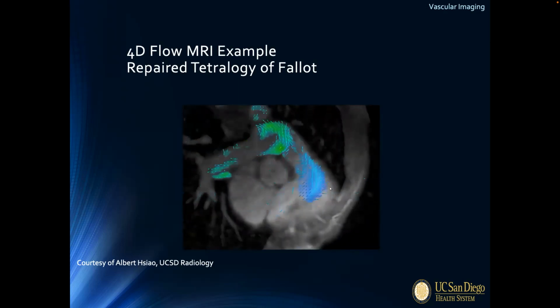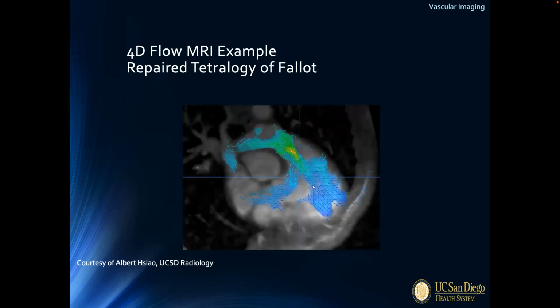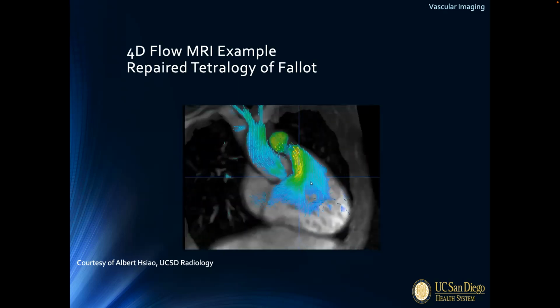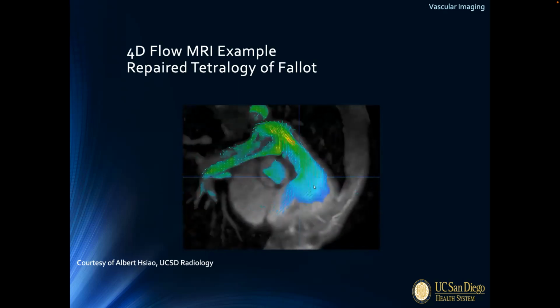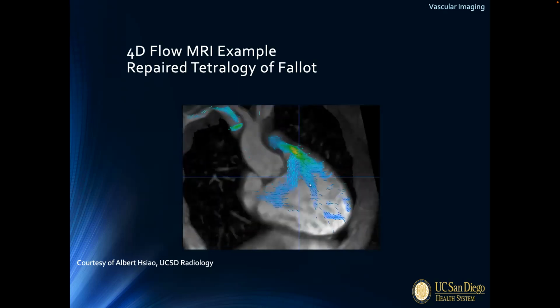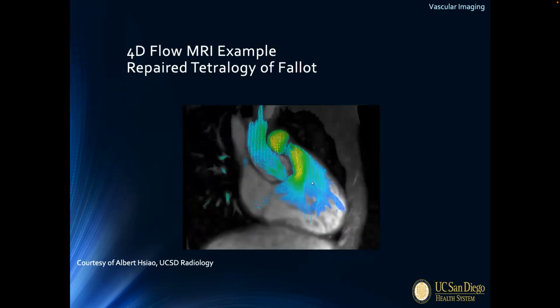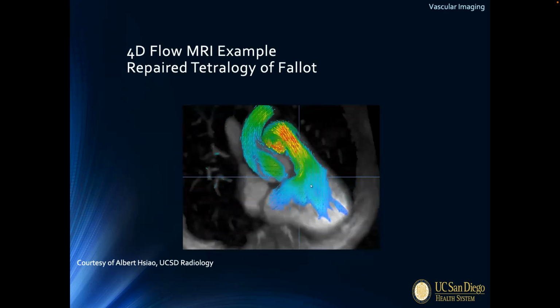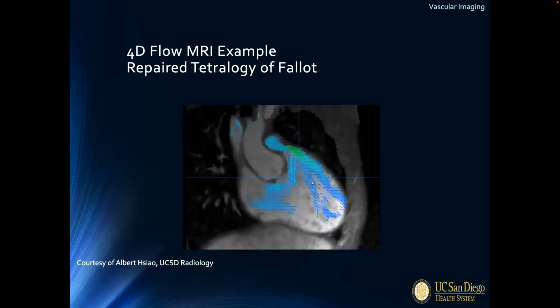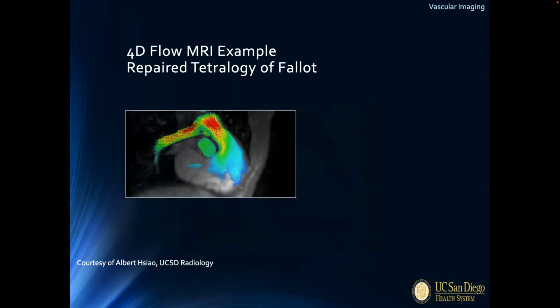It's called 4D flow with MR, and exactly as it sounds, you image a 3D vector field that represents the flow direction of the blood, and you measure those fields at different parts of the heart cycle. And you get these amazing evolving vector fields that tell you about flow function in the heart. He does this in 4D in the sense that it puts the patient in the scanner for a long time. They sit there, they breathe, and you correct for the breathing. And you know, it takes 20 minutes to get one of these because you've got many slices, a lot of vectors to encode, etc. But it gives you some very interesting stuff.